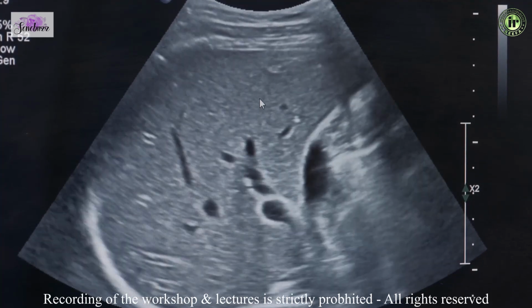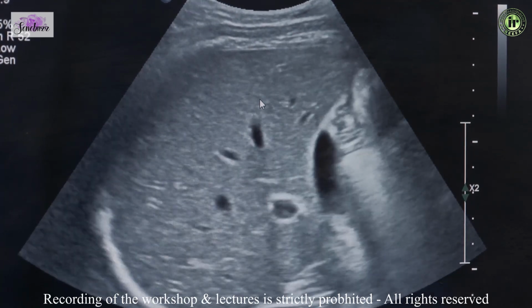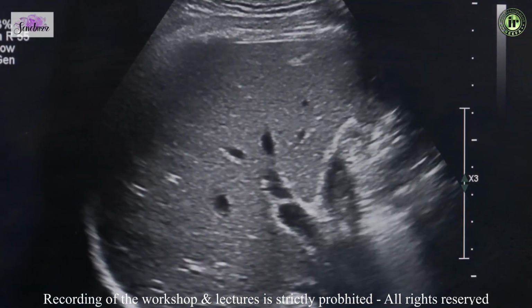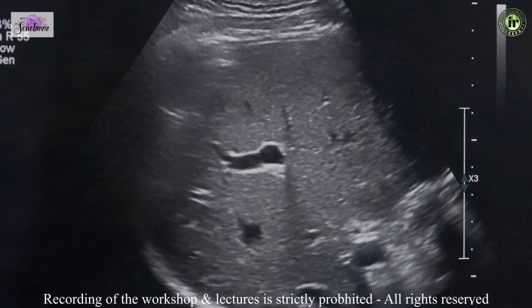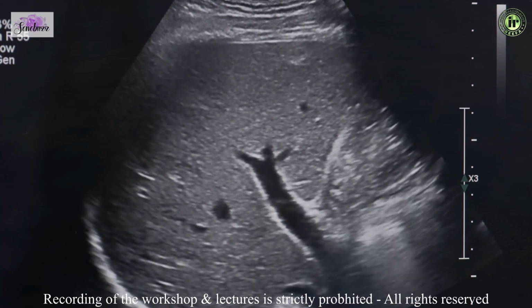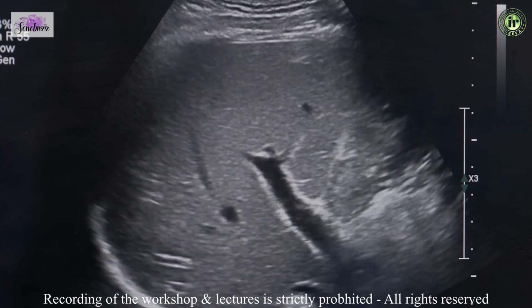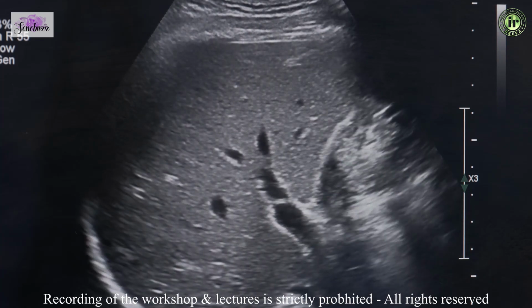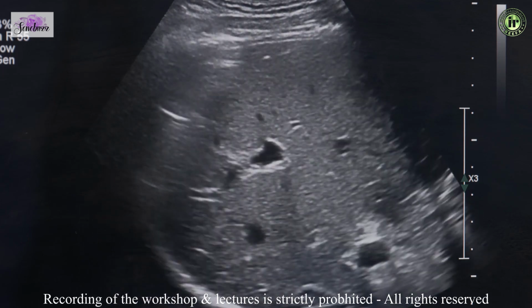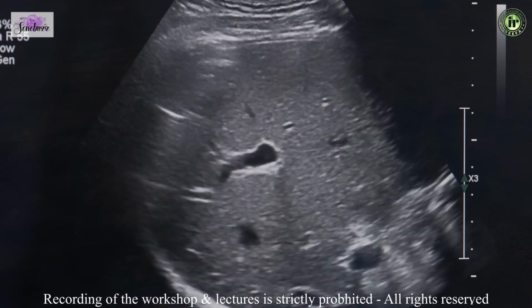Once we have determined where we are going to scan, we turn on our elastography mode. One more thing before we start taking our elastography values, we have to do a quick B mode scan. Have a look at how the liver is: is it coarse, is there any nodularity, routine things. Look at the portal vein. Have a look at the spleen. Are there any collaterals? Is there any ascites? Because this will give you a very good indicator of what we are going to deal with.